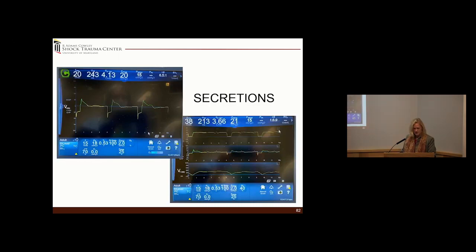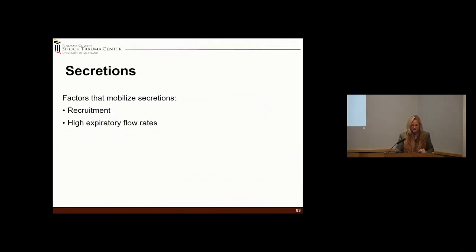This is compliments of Dr. Manugan, who said, "I think my patient, I think it's secretions." Sure enough, suctioned, and this is all it was. The patient was full of secretions. This is the other thing, and I'll actually reserve that because I have some examples.